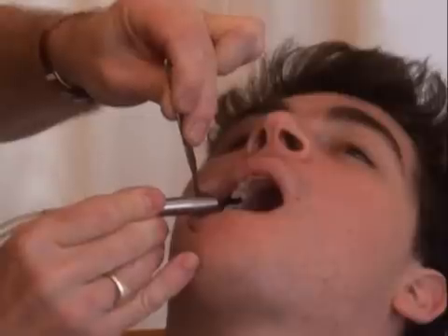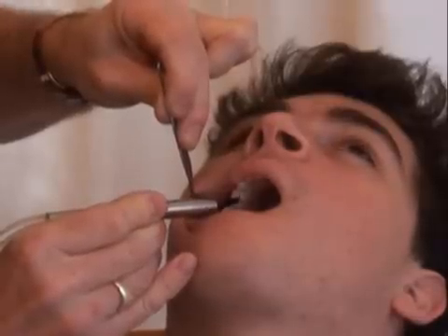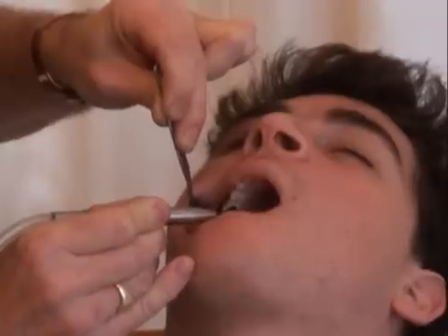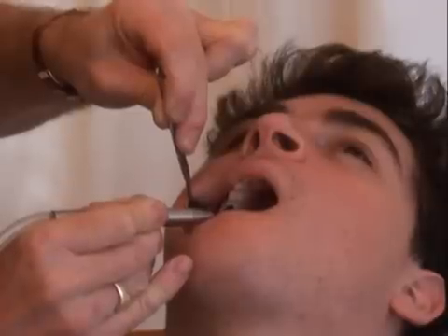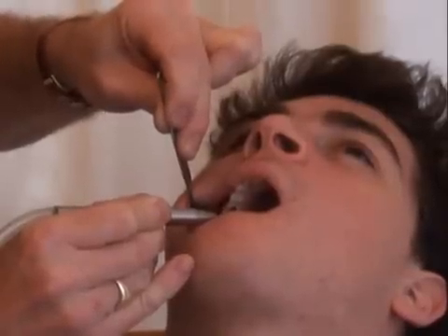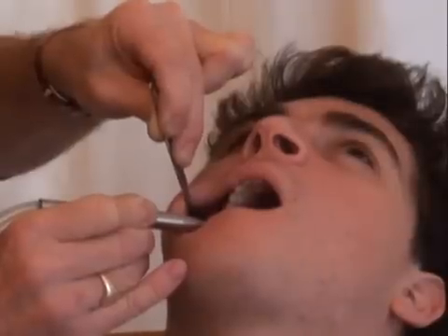And it literally is as easy as that. That is as hard as it gets. It's really the most boring definition in town, sadly. But it means there is no drilling, no filling. It's seriously obtained within 30 to 40 seconds.